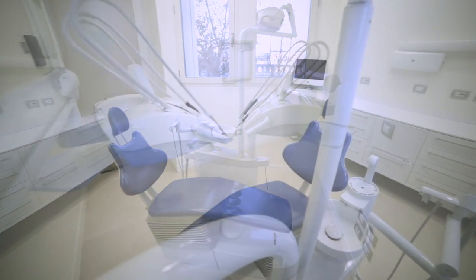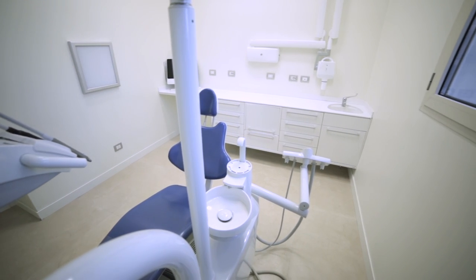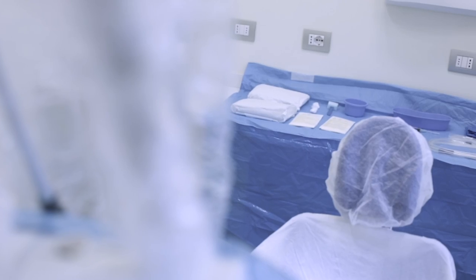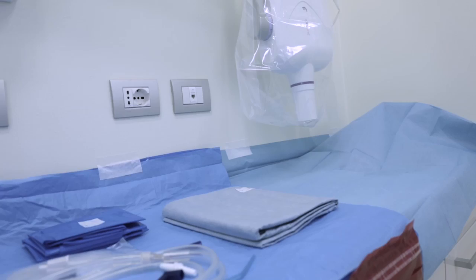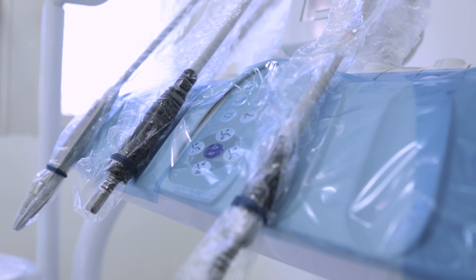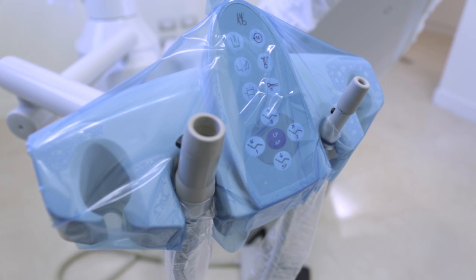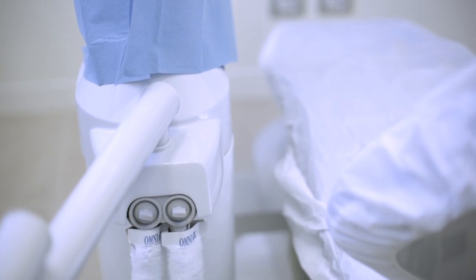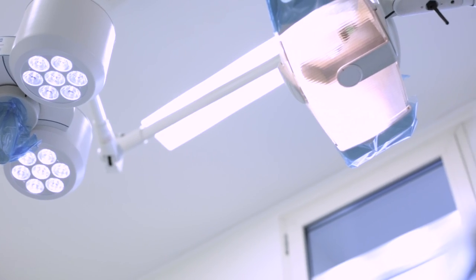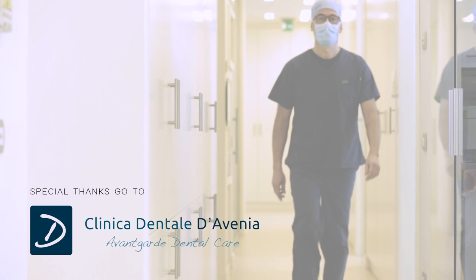Guidelines for the Dental Operating Room Sterile Setup. Proceed with disinfection of surfaces exactly as described for the operating room. However, the dental chair must be isolated with special waterproof non-woven fabric and medical PVC. The furniture in the room shall be used by the sterile operator as a support surface to open the set. As in the operating theatre, all electro-medical devices used must be isolated with sterile covers so that they can be safely handled. Suction tubes are protected by omnisleeve sheaths, whereas handles are isolated with adhesive films. The patient shall follow the same procedure as in the operating room.